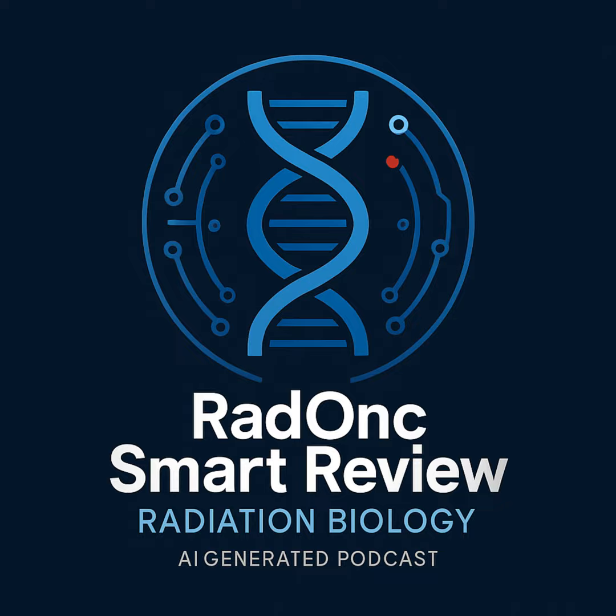Exactly. And that's where CT contrast agents come into play. These are substances we introduce to basically make certain areas show up brighter, right? By increasing the X-ray attenuation temporarily. You got it. Their effectiveness really boils down to two things: having a high atomic number, or Z, and achieving a good concentration where you want to see things. High Z elements just interact much more strongly with X-rays.